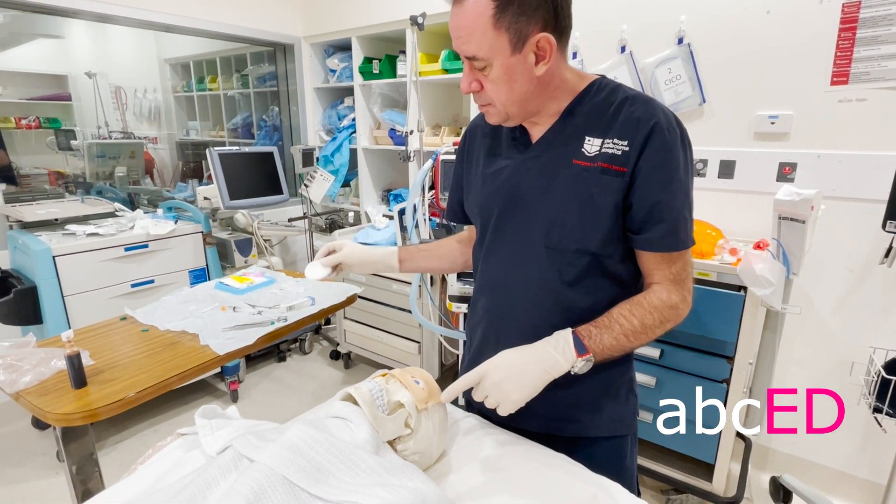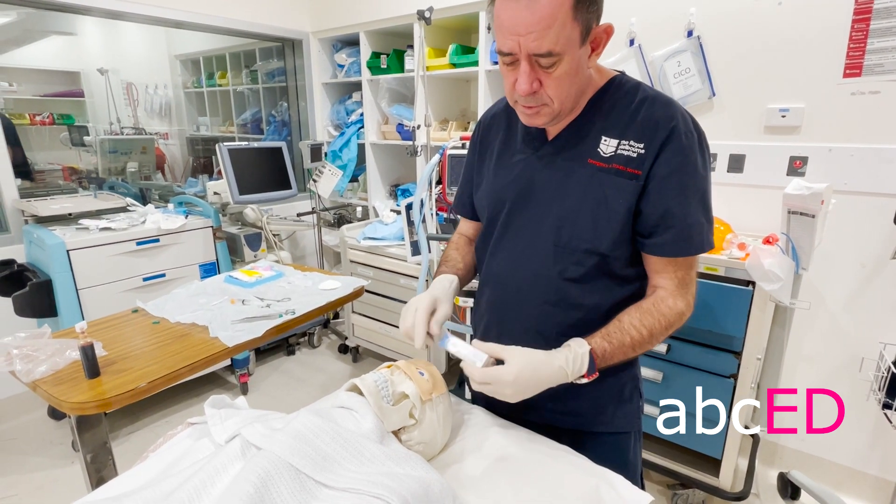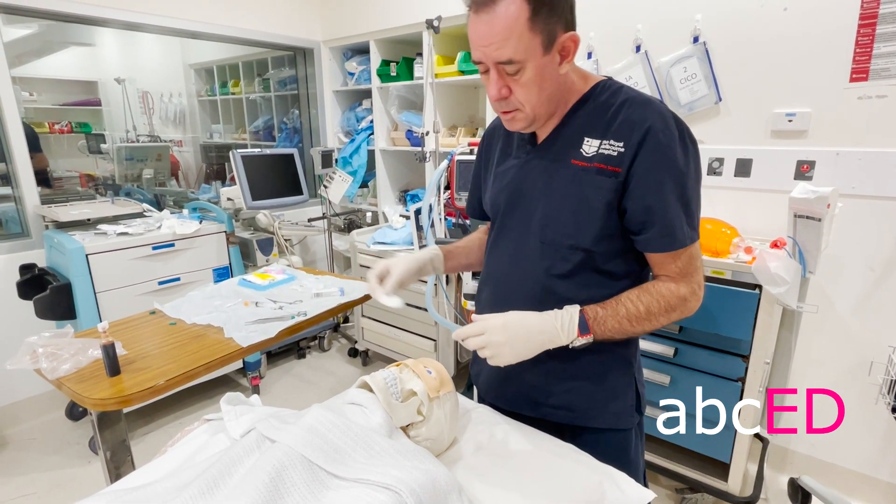This might bleed, so we'll pop some chloramphenicol ointment on and pad the eye.